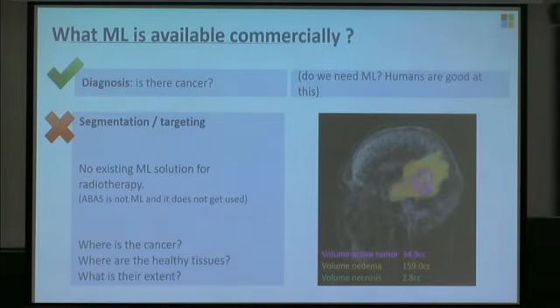But what I'm interested in, and we've heard a little bit about this in the previous session, is the importance of segmentation. Now, in the radiation oncology workflow, this is really important because the start of our workflow is to build a digital model of the patient in a computer so that we can do three-dimensional treatment planning. And that means segmentation of the tumour and segmentation of all of the healthy structures that need to be shielded from radiation. So no segmentation, no radiotherapy, end of. Okay? So we're in a sort of interesting situation, really, to consume these types of technologies.